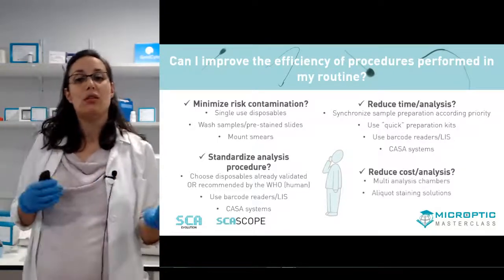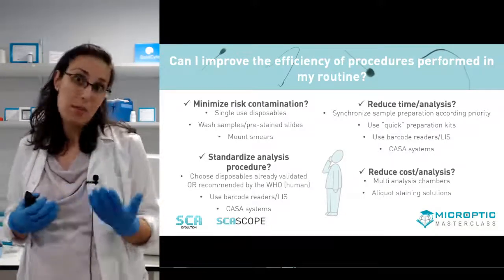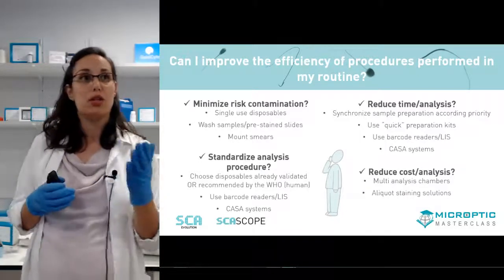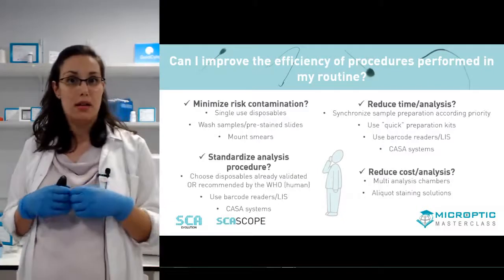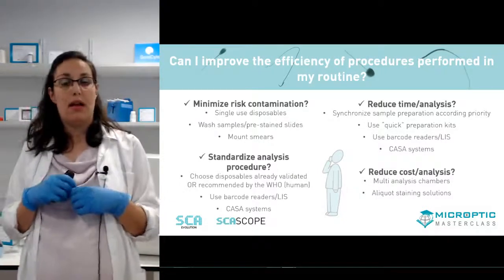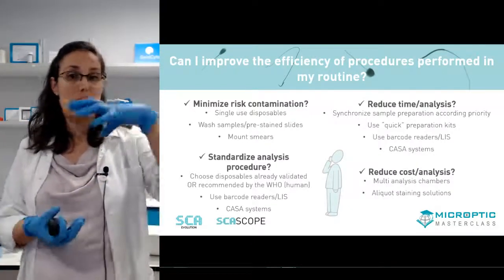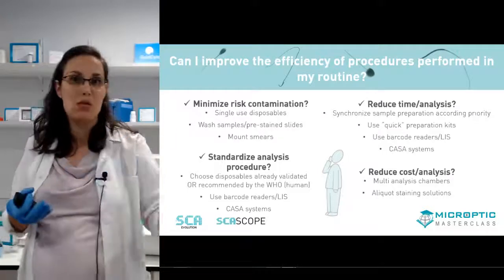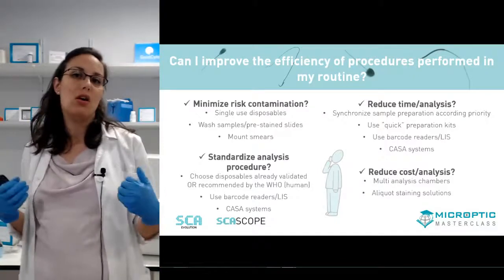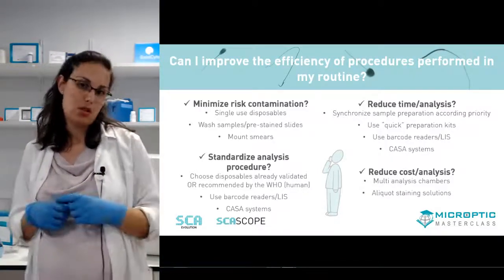Concerning how to reduce the cost of each analysis, depending on the number of samples that you are working with, you can select some disposables with multi-chamber slides, or maybe a reusable counting chamber, or also if you are using staining solution, you can make some aliquots and preserve the stock solution in the fridge in order to enlarge a little bit the life period for that solution.